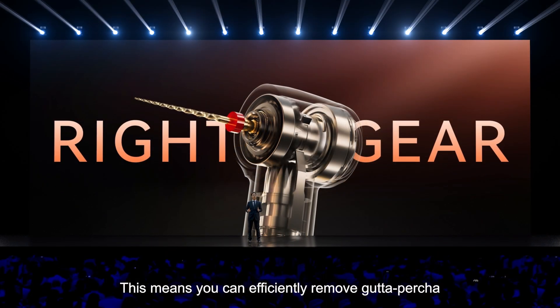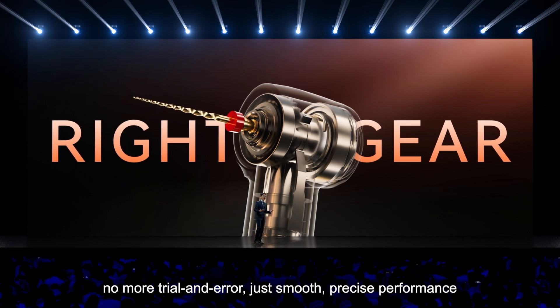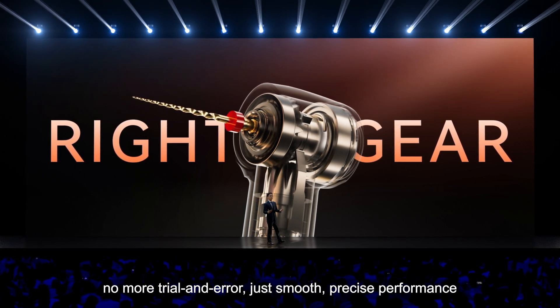This means you can efficiently remove gutta-percha during your treatment. No more trial and error — just smooth, precise performance.